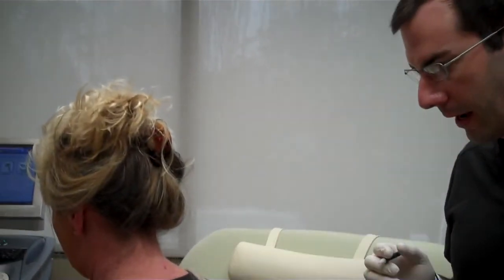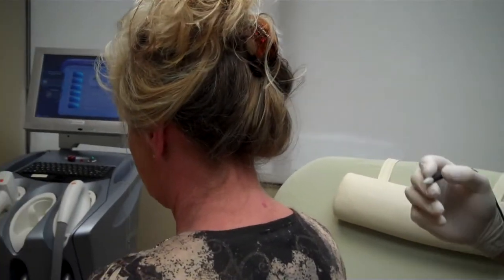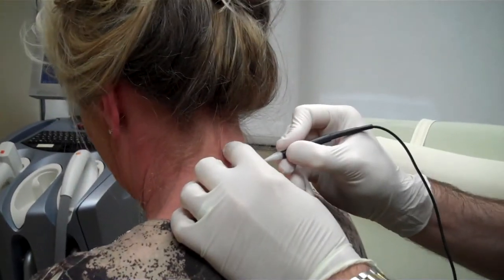I just wanted to shoot this video to show you how easy this treatment is to get through. She didn't have hardly any pain at all with the first one.